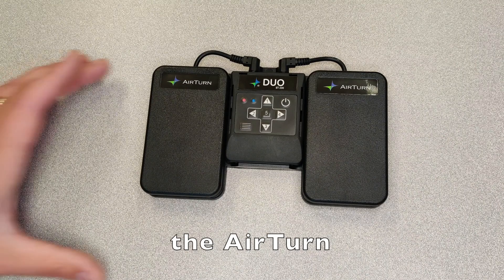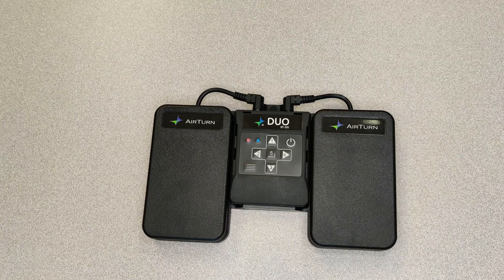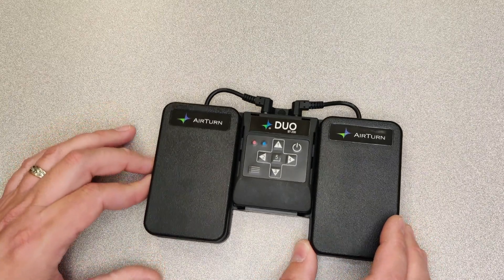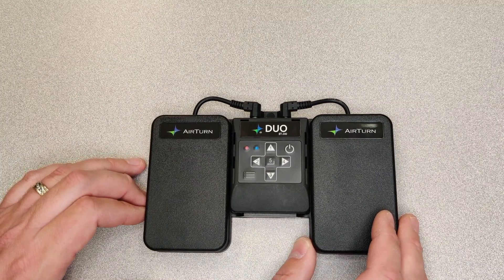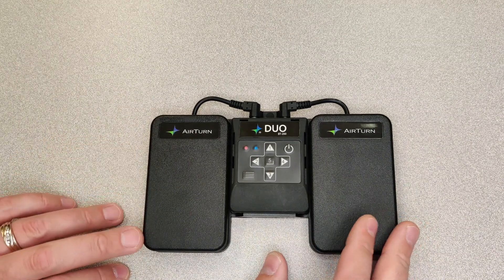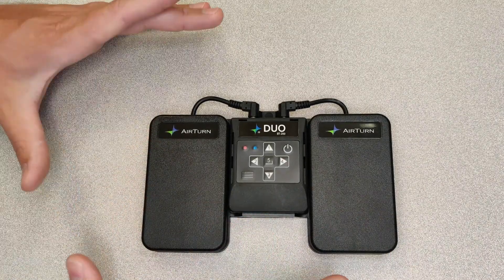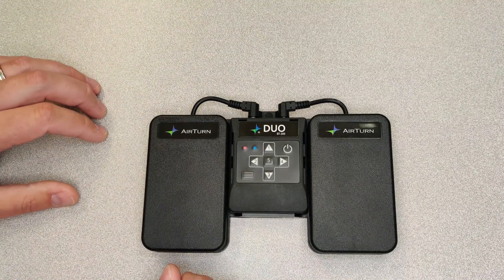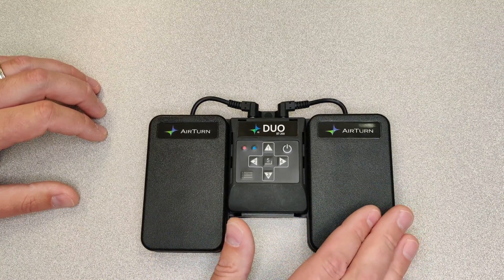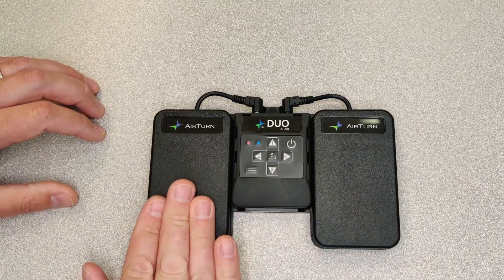What we see here in front of us is the device that we purchased a while back. We purchased this for the foot pedals. We had a student in the music department who needed to be able to progress the music. We use this device in conjunction with an application called FourScore — it's an iOS app. Under the accessibility of that app, you can magnify the size of music sheets, and you can use this AirTurn device to connect and progress the speed of the music shown on the sheet. As they're learning how to play, they can hit the right side to increase the speed or the left side to slow it down.